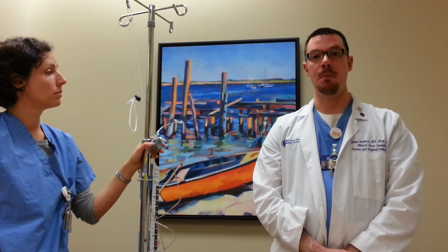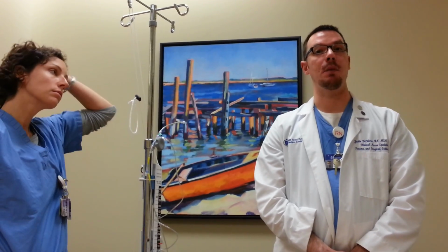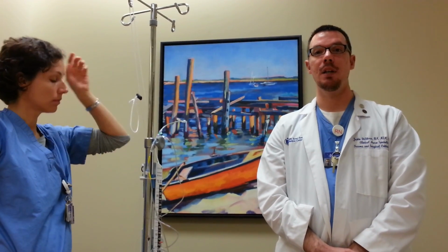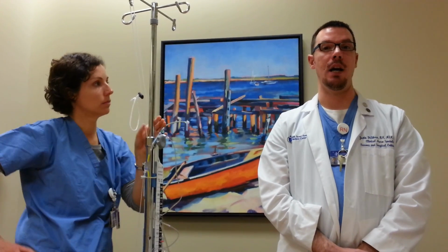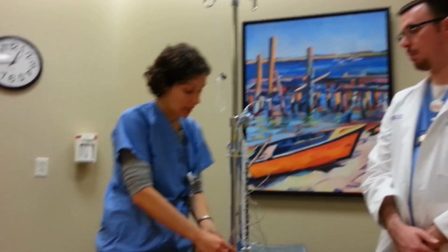And opening to monitoring allows us to alarm. If you're transporting your patients and the patient develops a high ICP, you can always stop, re-level, and if you need to, you can drain CSF. And I don't know if you want to say a word about how you might manage that.